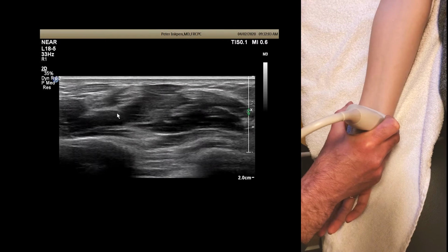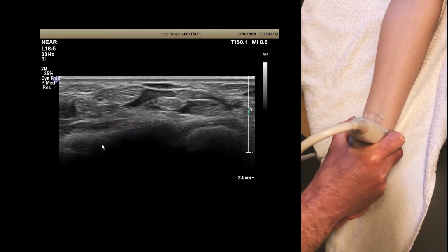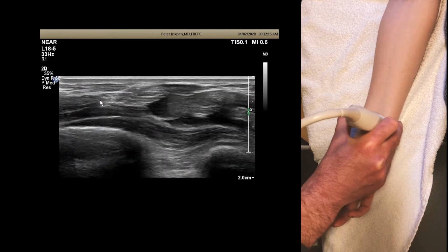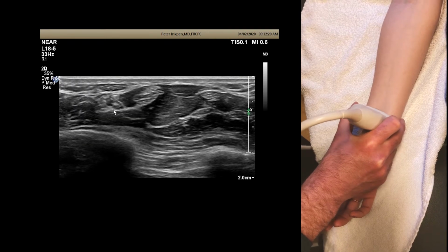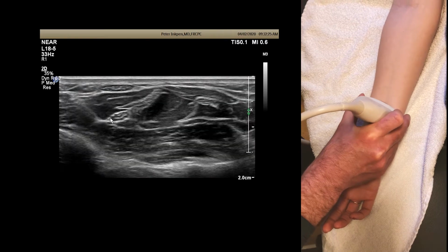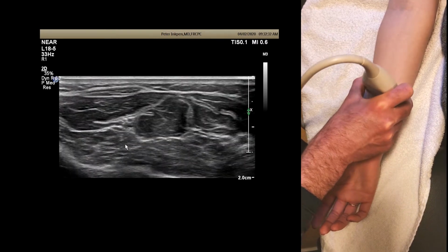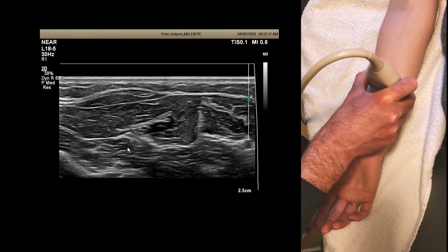Now we're going to scan proximal. And what happens here when we start scanning proximal, just a few centimeters proximal to the wrist, is that the median nerve is going to go radial. And so it takes this radial dive across flexor pollicis longus to lie deep to FCR. And then comes back again, scoops underneath, and at this level goes between the superficial and deep compartments.